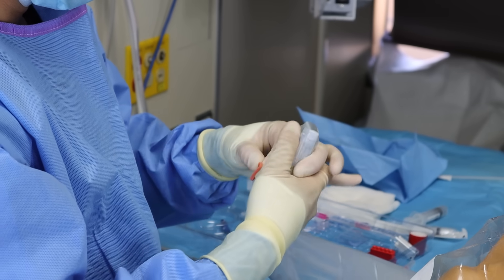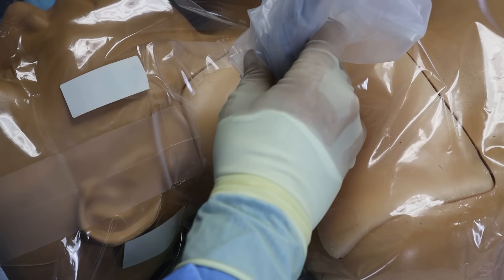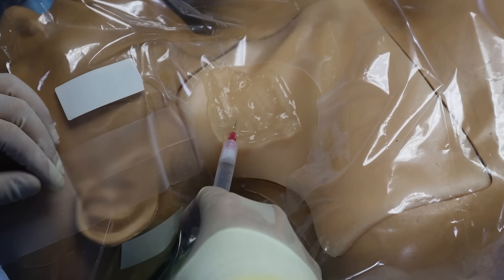Remember, air is the nemesis of ultrasound. Put your hand through the poochy tip of the probe cover and then reach out and grab the probe. Use your fingers to snug the probe cover up against the probe, removing any folds in the plastic. Massage any air bubbles in the gel away from the tip of the probe. Then apply the rubber bands to secure the cover. Next, slap some sterile gel onto the patient and have a look with the probe again. Having confirmed where I plan to make the puncture, I inject lidocaine subcutaneously.